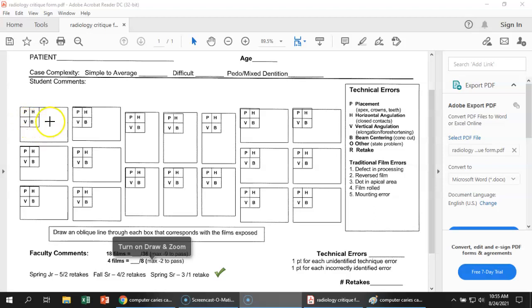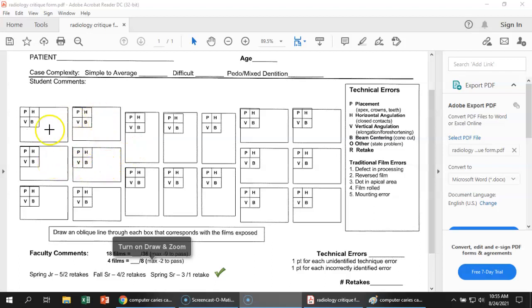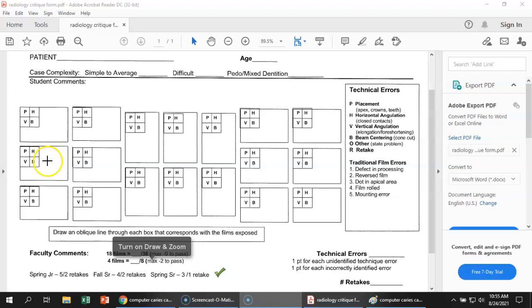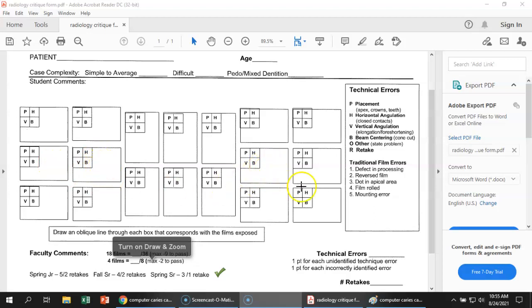Each one of these boxes coordinates with a PA or a bite wing x-ray that you're going to take. So in a full mouth series, we have all these 18 films. In the four bite wing series, this is the right molar bite wing, this is the right premolar, this is the left, and this is the left molar.